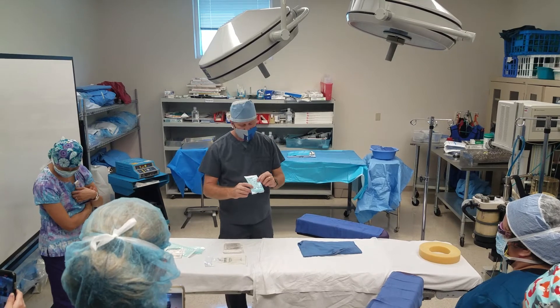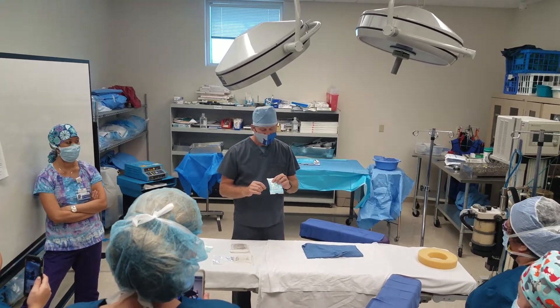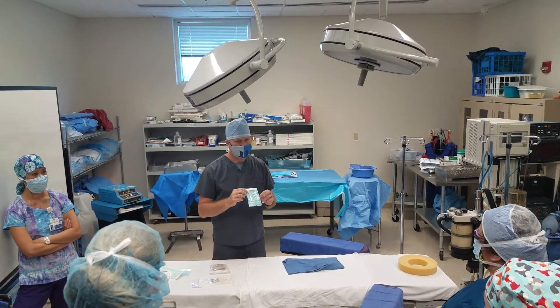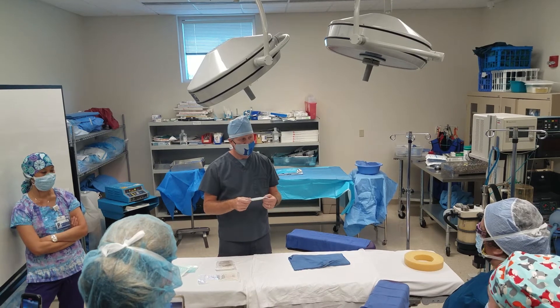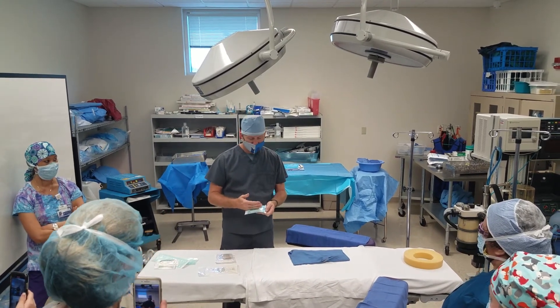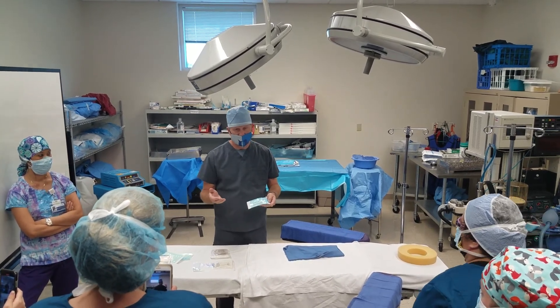When you peel it apart, you see this side is glued — the two pieces are glued together. That glued edge is not considered sterile. So when you open this and dispense it, the item has a tendency to slide off that edge. If it slides off the wrapper, it's contaminated.